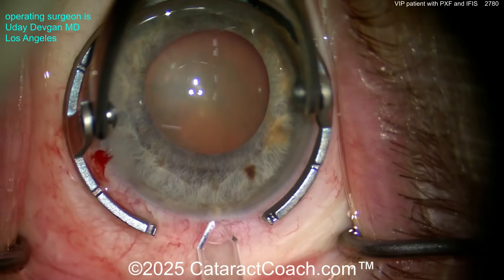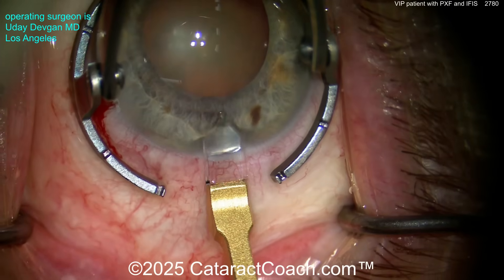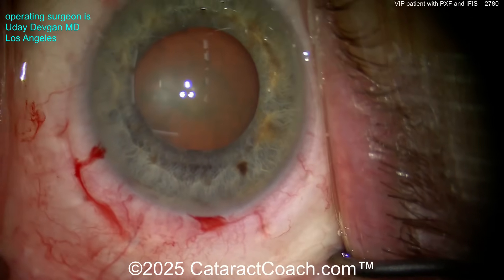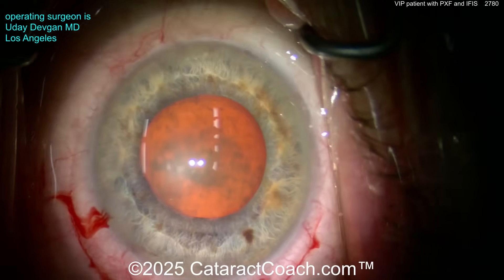Here's the fixation ring. Here comes the diamond making a phaco incision — it's a 2.0 millimeter diamond. We'll enter here and make it a little wider, maybe about 2.2 to 2.4 millimeters, somewhere in that range. Notice how I hit the limbal blood vessels in order to get great long-term sealing — don't make incisions that are totally avascular.